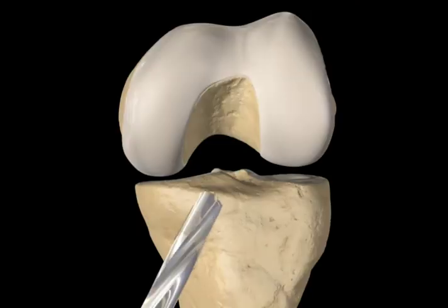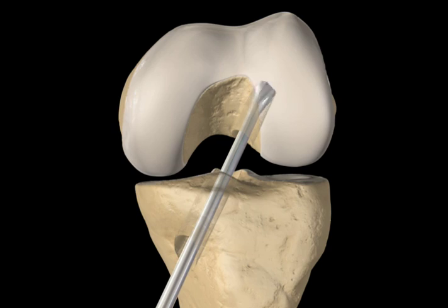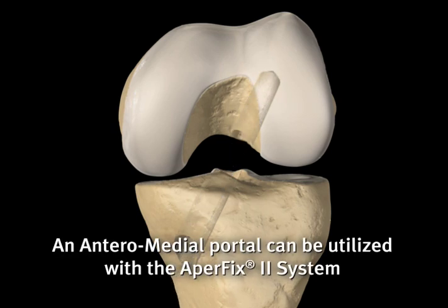The tibial tunnel is drilled to the same diameter as the implant size being used. The femoral tunnel is positioned in the center of the femoral footprint, low on the femoral notch, 1:30 to 2 o'clock in a left knee and 10 o'clock to 10:30 position in a right knee.